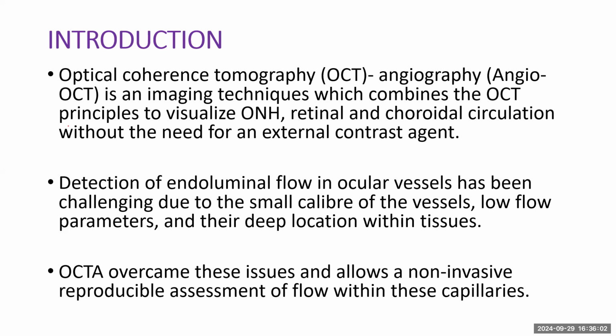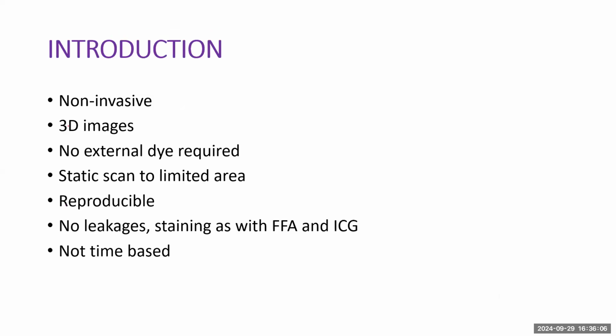Being non-invasive and reproducible also makes it handy for clinic use. The images can be in 3D, and you don't need an external dye. It's a static scan with a limited area of interest, although wide field OCTAs are now being developed. Unlike FFA and ICG, there are no leakages and it's not time-based.